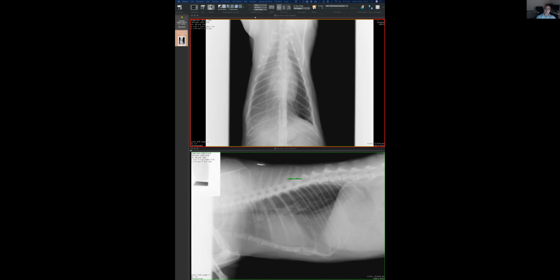So if you go to the abdomen, we are going to talk about it. When we are in the thorax, it is all about silhouetting between soft tissue structures: lung, vessels, heart, diaphragm. If we see them, if we don't see them. If we go into the abdomen, it's going to be all about soft tissue and fat. Makes sense? It's the peritoneal fat. Those are going to be our two main players. There is gas in the GI tract, but that is if we are lucky. Sometimes there is not. And then we are left with these two components, fat and soft tissue. Thorax is more soft tissue and gas. Makes sense? This is the game that we play.